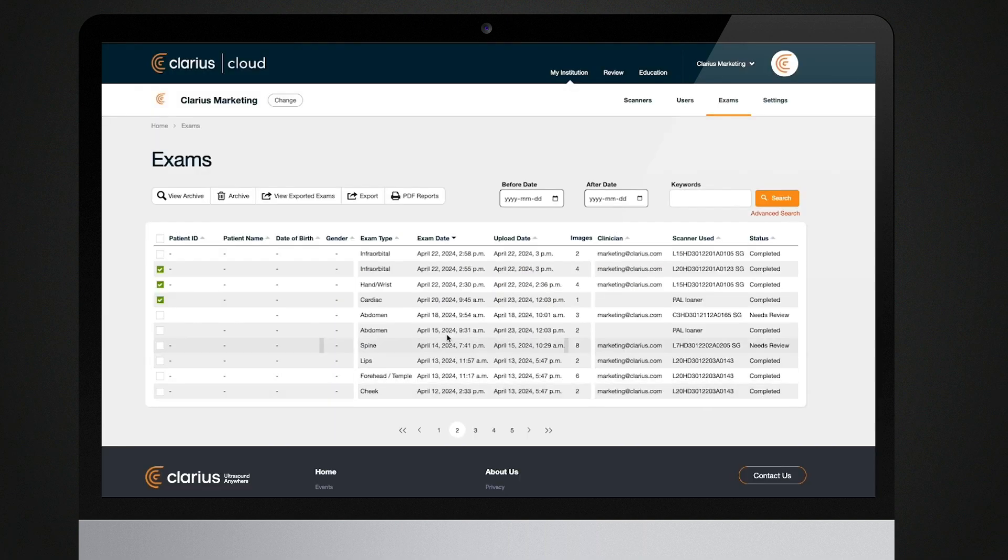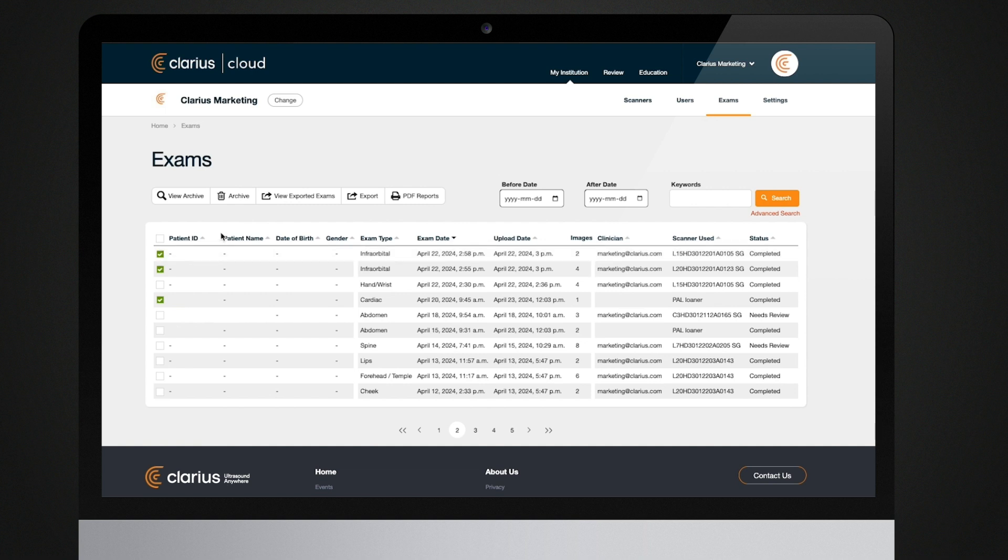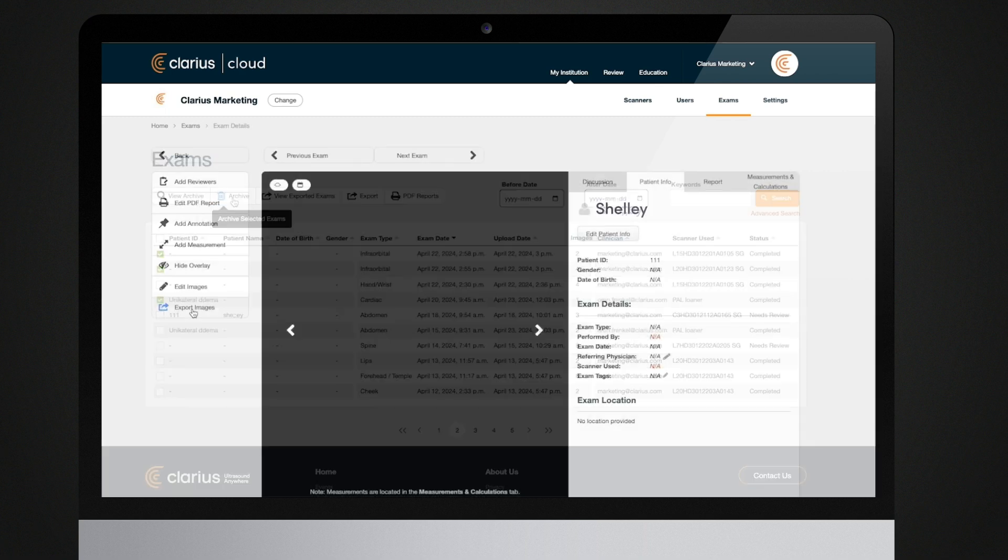If you wish to delete an exam, you can archive them from the exams page. These exams will be hidden from your list. These exams will not be deleted and you can recover them at any time from your archived exams page.